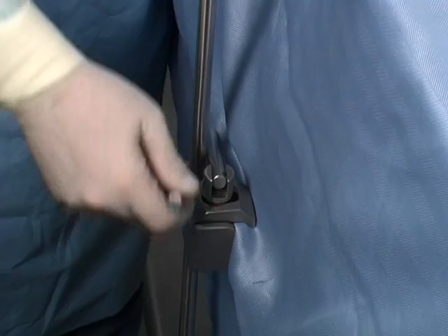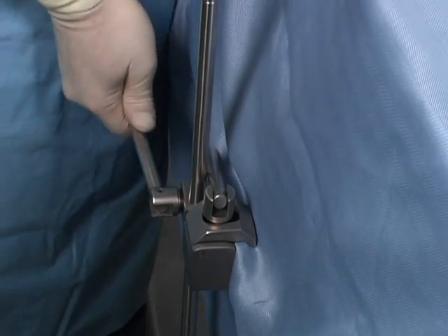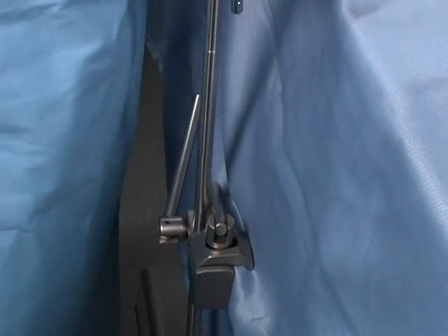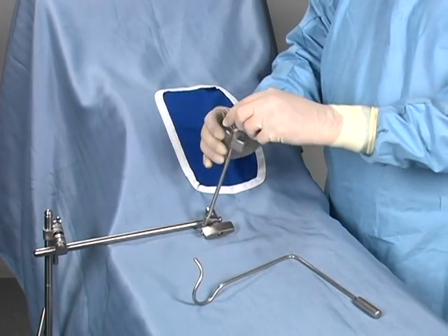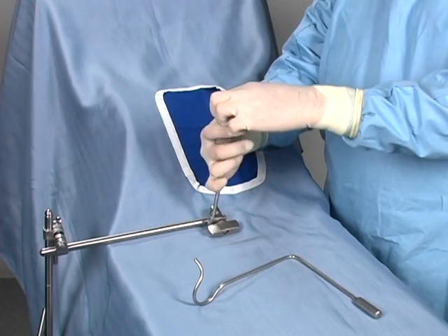Attach the power rail clamp to the OR table rail over the sterile drape. Secure the upright post to the rail clamp. With both joints loosened on the extension arms, secure the holder's jaws to the retractor.